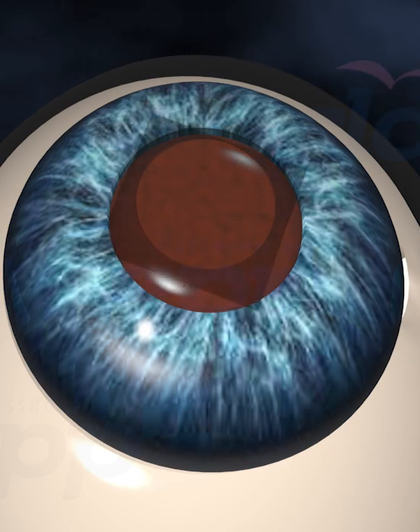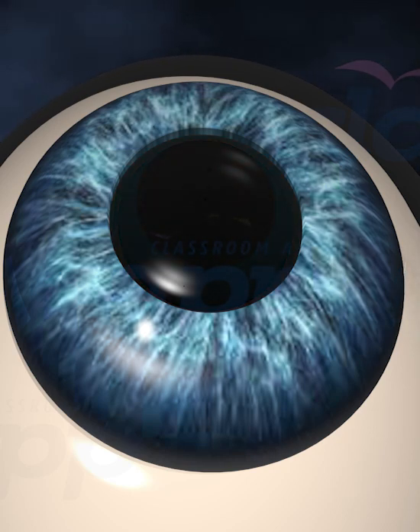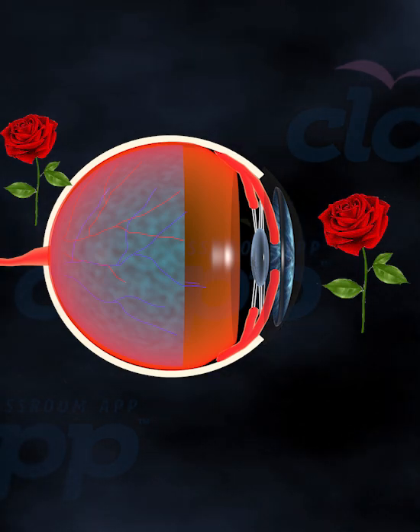This implanted intraocular lens is fixated and centered in the eye and the incision is self-sealing. This new lens will restore your vision like natural healthy lenses and often correct any existing refractive errors.